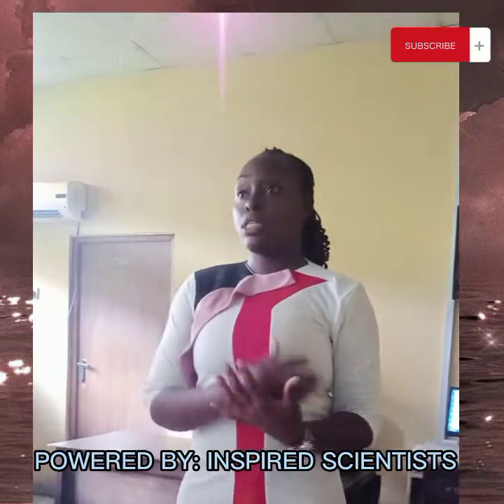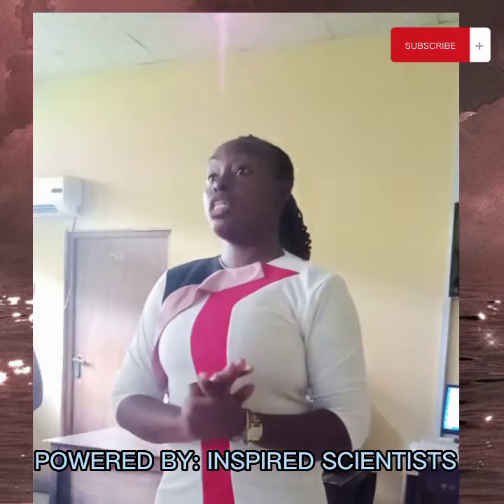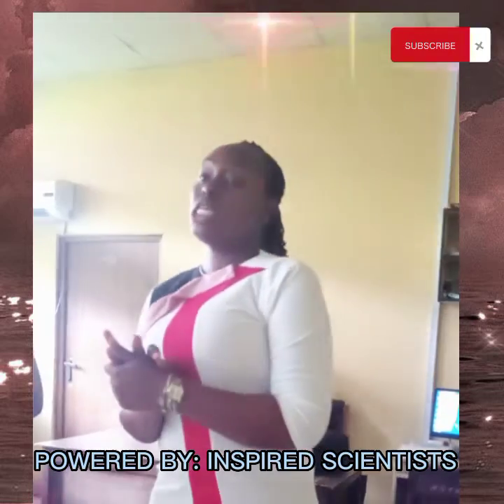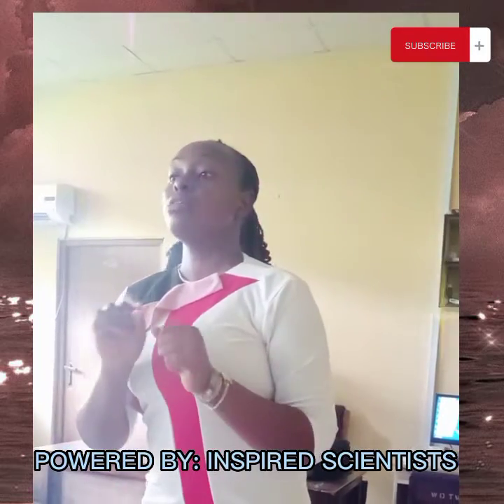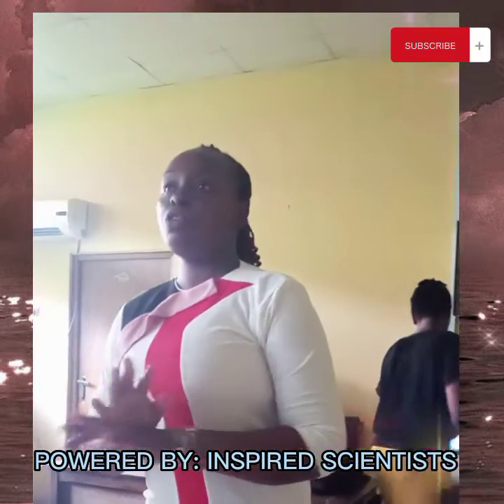So if the test is the patient sample, and the result you got probably is 12 or 13, then when you want to interpret, you say since the test falls within the normal range, the PT is normal. The PT of the patient is normal.